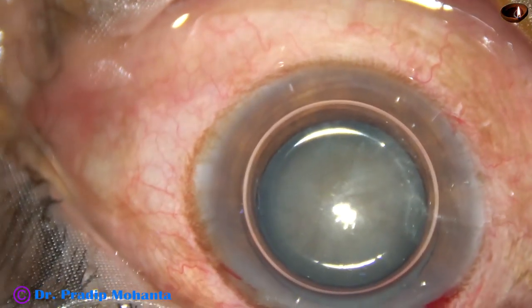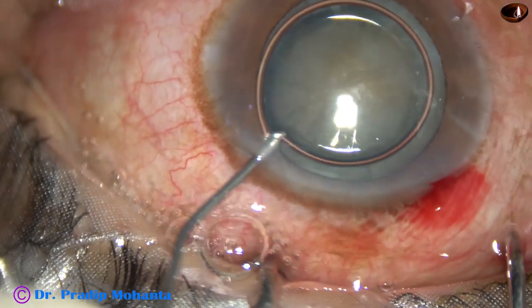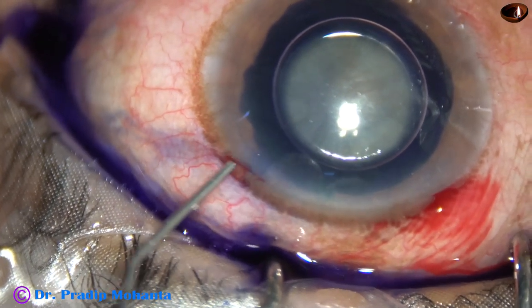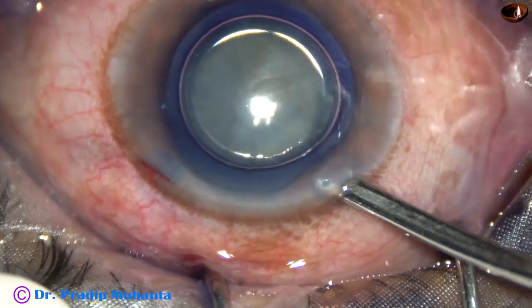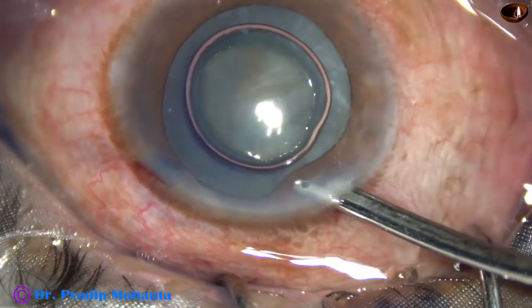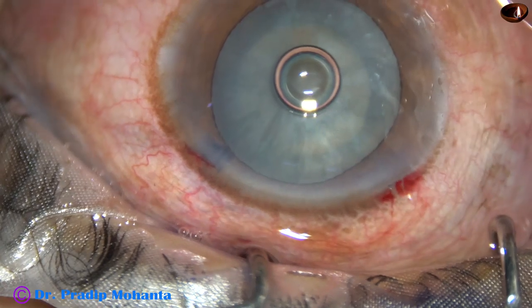Now an air bubble has been injected. Beneath this air bubble, here goes trypan blue dye. And this is a little bit of adrenaline. Now the dye is nicely washed out and we can see that the capsule has stained very nicely.